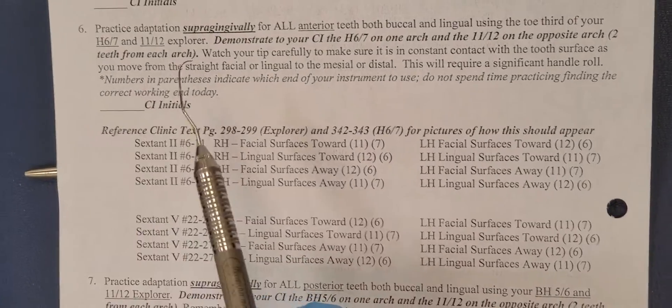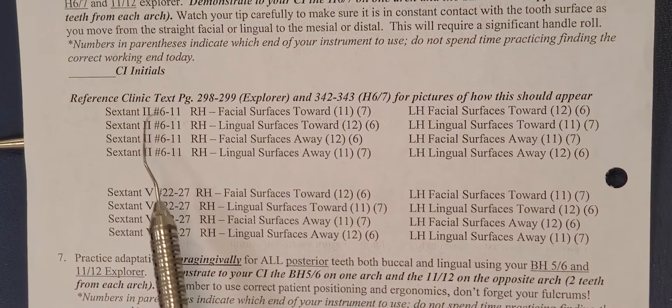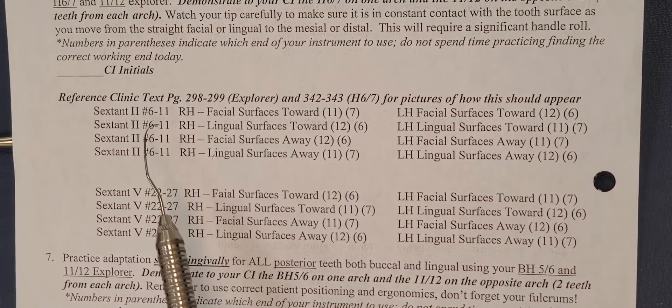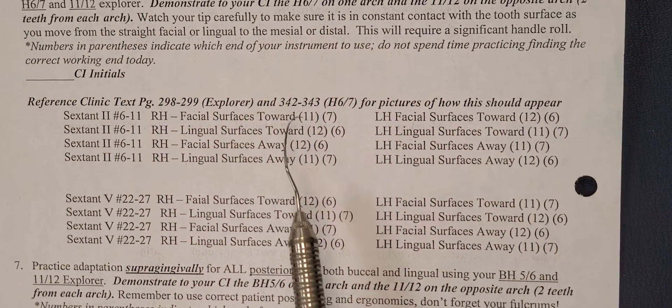Going on to the next part of the lab activity, I'm going to start in sextant 2, in between teeth 6 and 11, so I'm going to choose number 9. I'm right-handed and I'm going to do the facial surfaces towards, so I'm going to use end number 11.